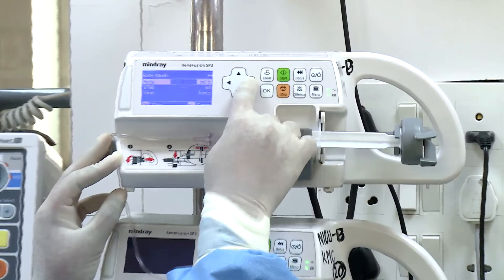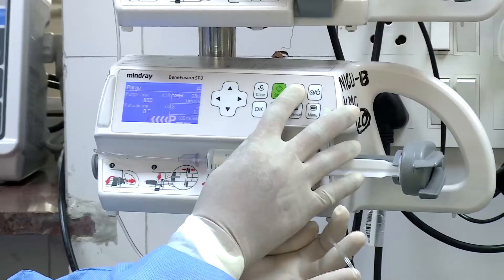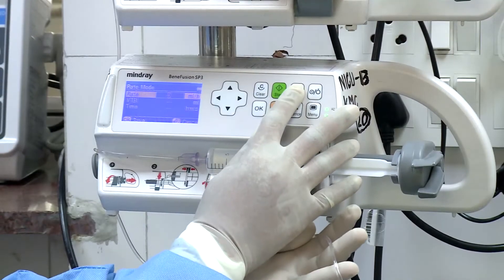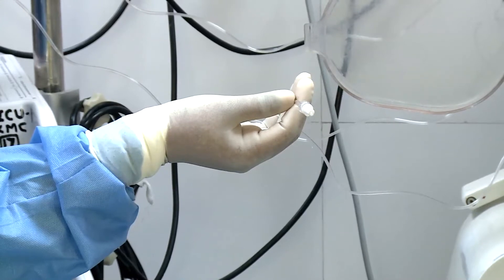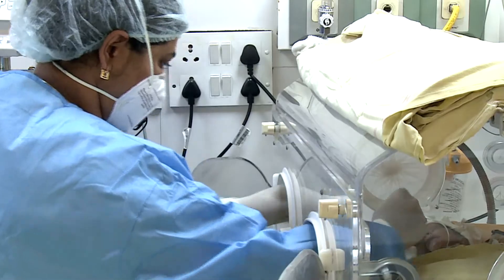Set the infusion rate using the up and down arrow keys in the control panel. Press the prime button to flush the tubing to remove air bubbles. Connect to the patient by ensuring patency of the IV line.